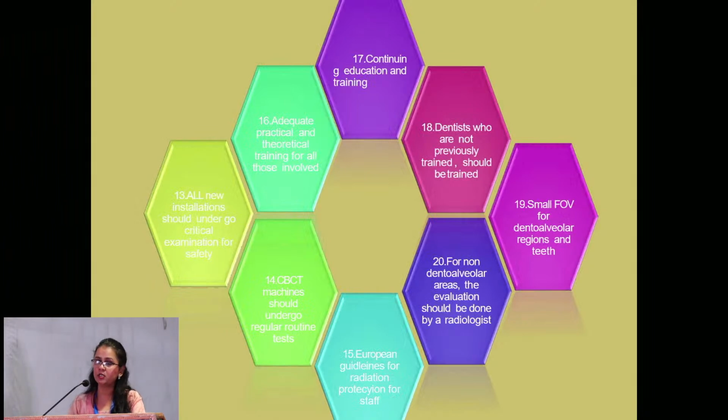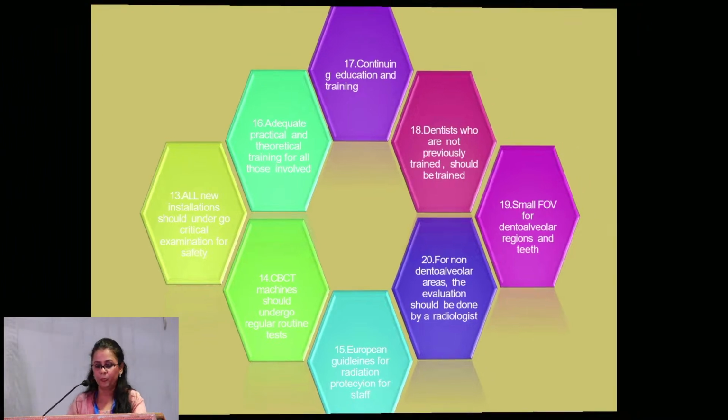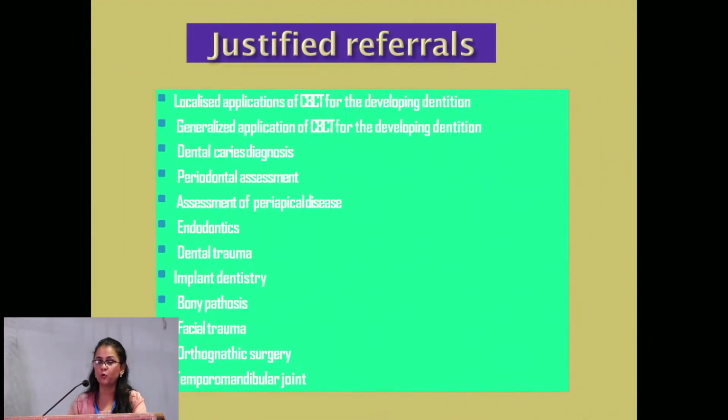And as far as possible, to arrive at a diagnosis, a decision should be taken whether we should go for a small field of view, whether a high resolution should be taken, whether both the arches should be taken, or a full skull should be taken. Don't overexpose and do multiple exposures to the patient.